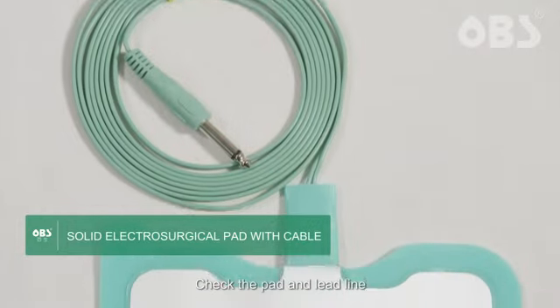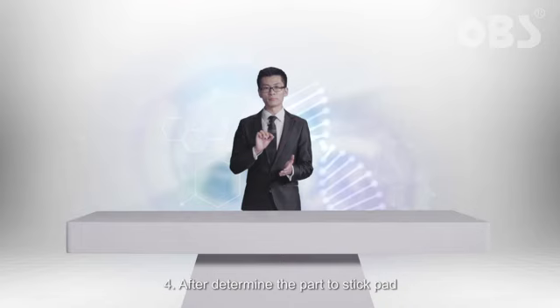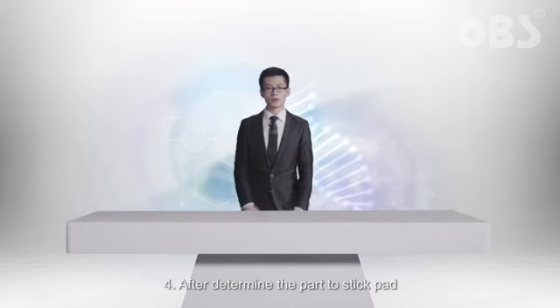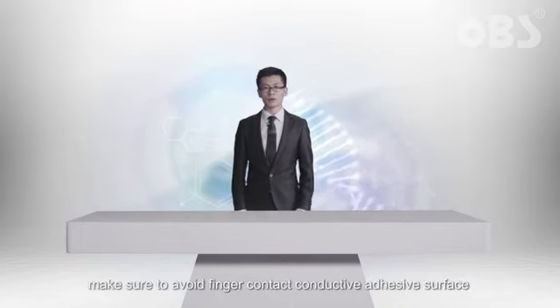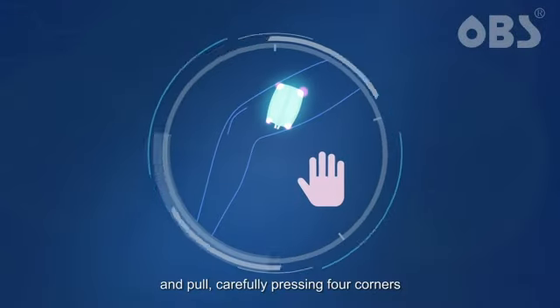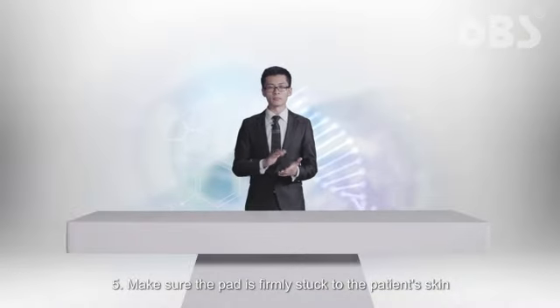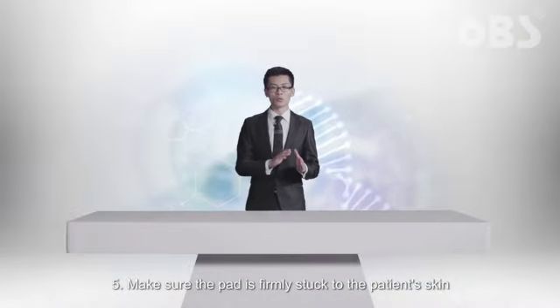3. Do not open the package until you are ready to paste the pad. Check the pad and lead line. Do not use if the product is out of date or unsafe. 4. After determining the part to stick the pad, avoid finger contact with the conductive adhesive surface, pull it carefully, and press the 4 corners. 5. Make sure the pad is firmly stuck to the patient's skin.